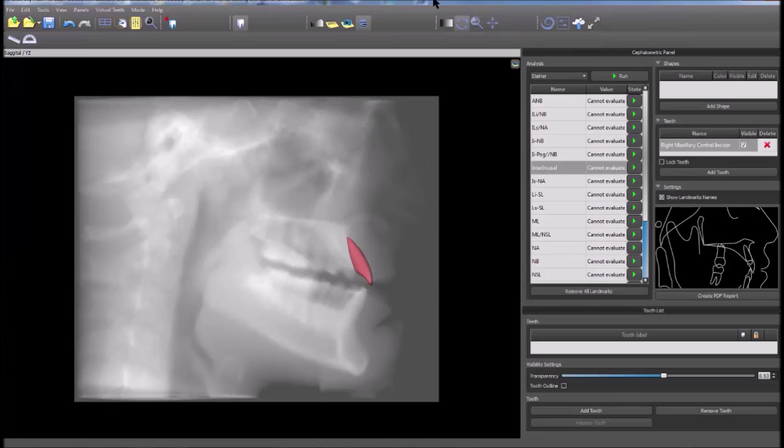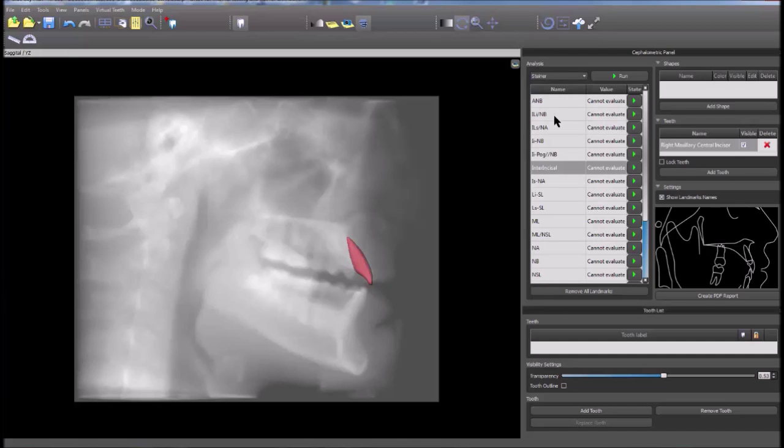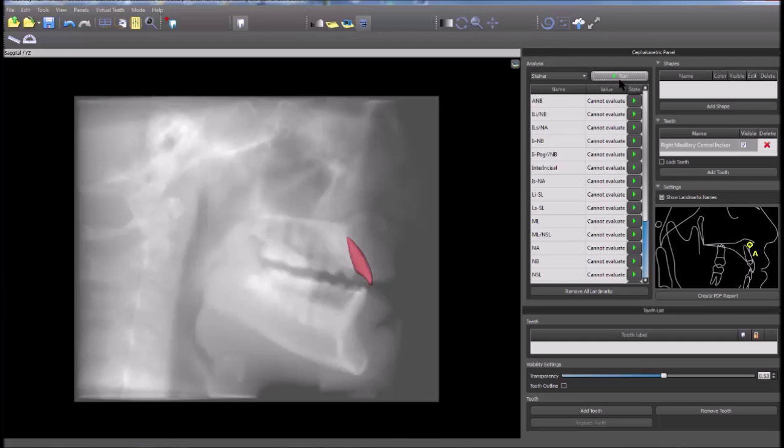The desired analysis methodology can be selected by going to the analysis drop-down and choosing the desired options. Click run to begin point identification. Select the relevant points on the image by using the sagittal outline guide in the lower right panel.